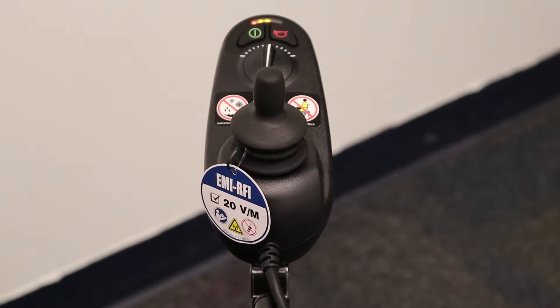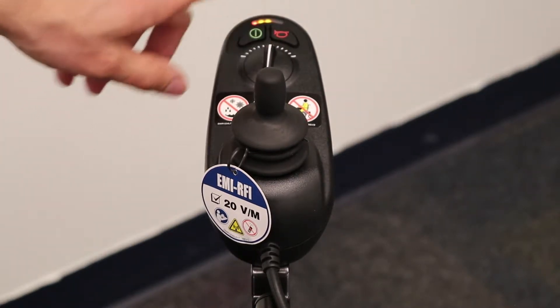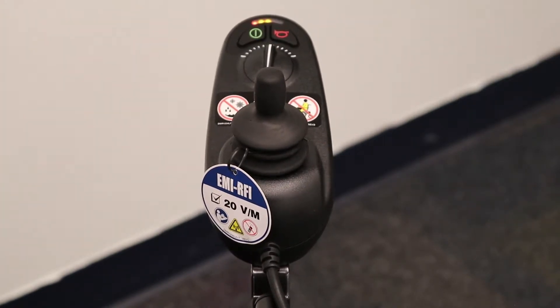This power chair is rated to get you about 8.7 miles per charge. Also, looking at the joystick, you have a red horn button, which will make a beep sound when you press it, as well as the speed dial.